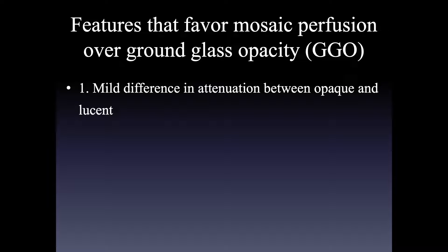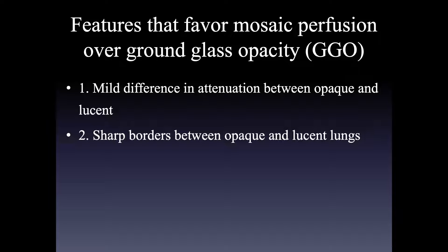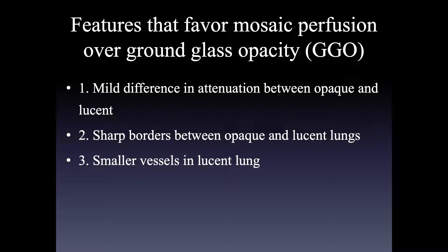In many cases there is a relatively mild difference in attenuation between the opaque and lucent areas, and the lucent areas are very sharply demarcated — you can draw with a pencil the lines between the two. Sometimes you have smaller vessels in the abnormally lucent lung and bigger vessels in the more normal opaque lung. That finding is helpful when present, but in many cases of airways disease the vessel size is the same, so it's helpful when present but not helpful when absent.